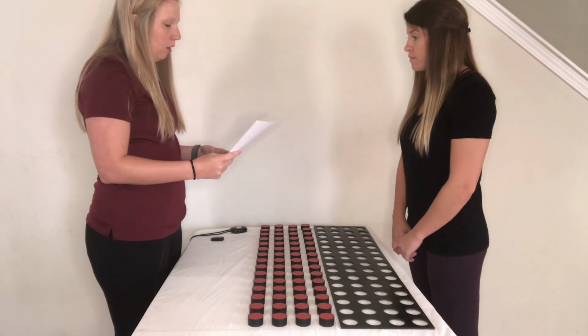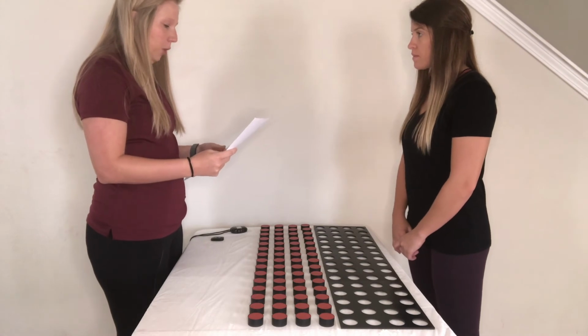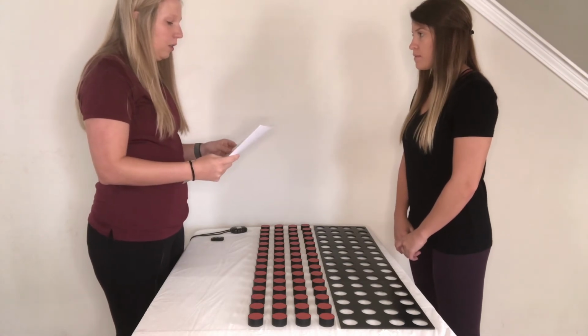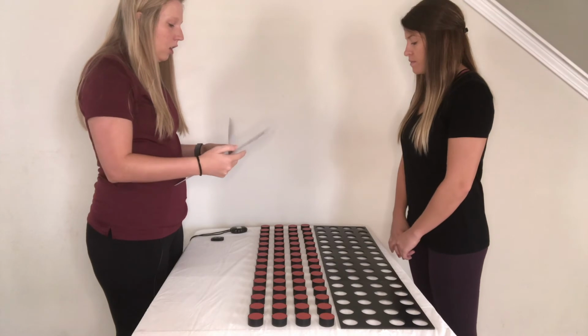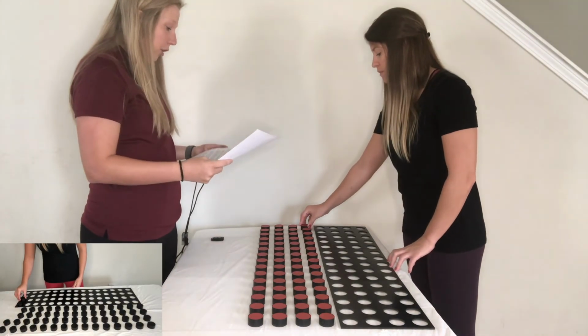When you finish one trial, we must rearrange the board and discs into the starting position before starting another trial. Please do not touch the discs until you hear further instruction. You may put your hand on the first disc. Ready? Yep. Go.